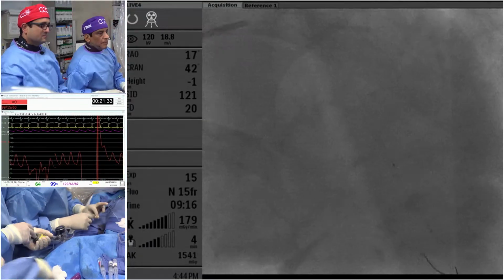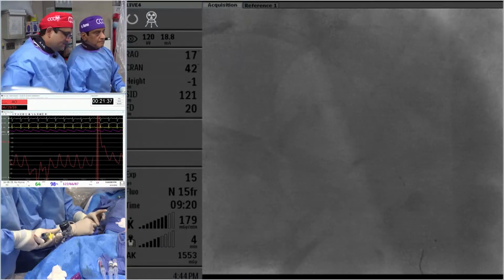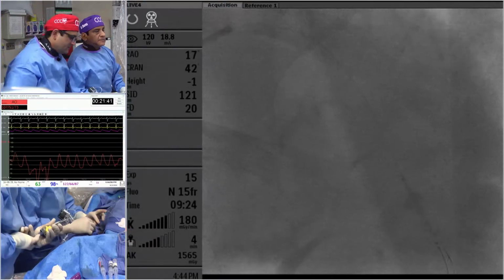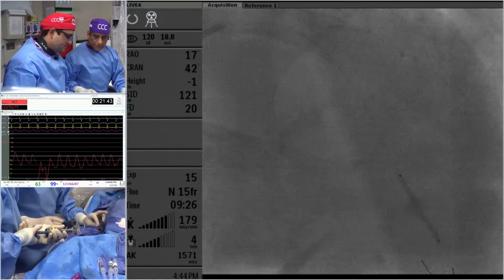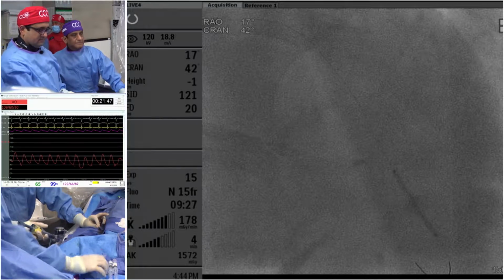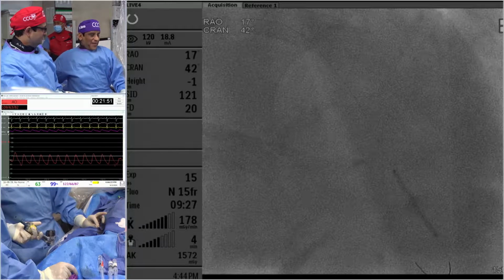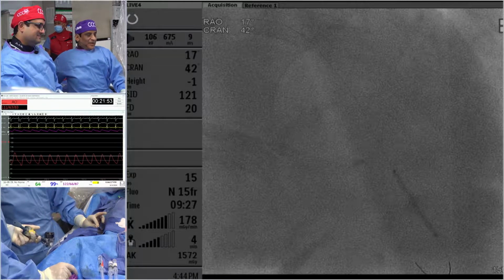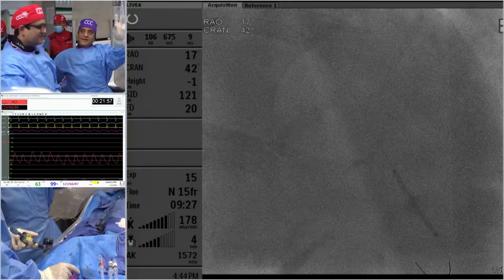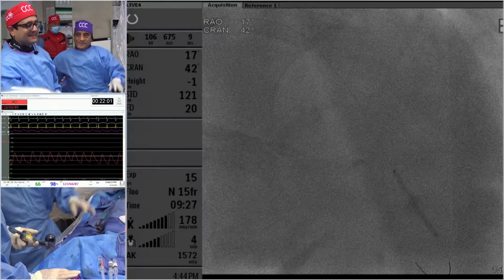First of all, next week we are coming to 100 cases I've done in our webcast here. I have never even seen a patient with an ejection fraction of 53% and a Syntax score of 9. How exactly did this patient reach Mount Sinai? That's one. The third is the top. The patient has the RCA, 2 branches of the circumflex, and this is the last leg of the diffuse disease.